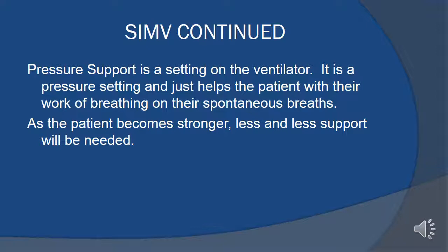So the pressure support setting initially may be very high. As they get stronger, then we can start weaning that support down.